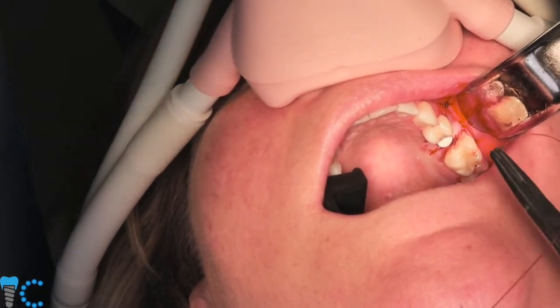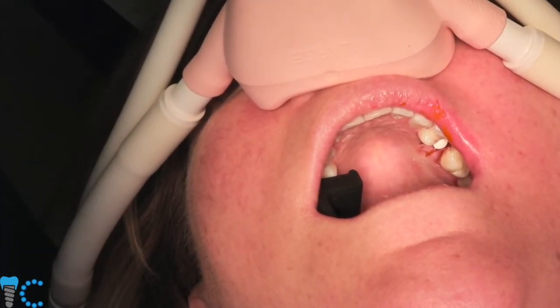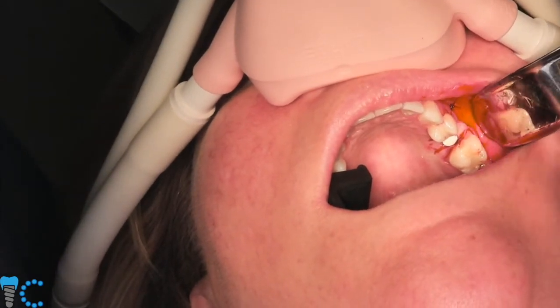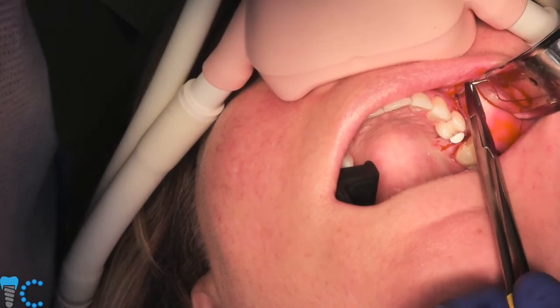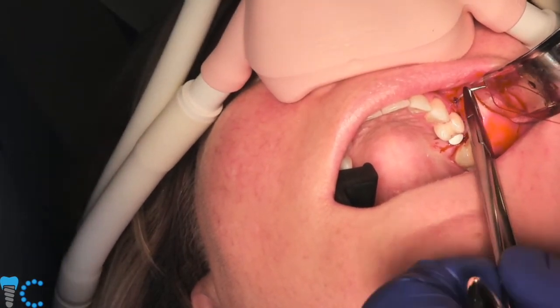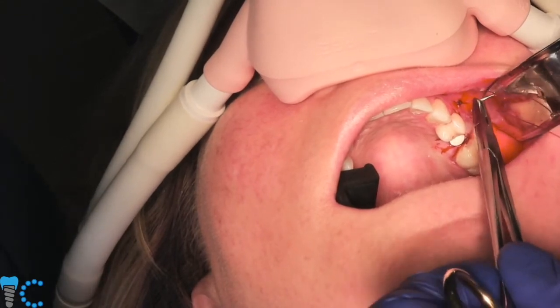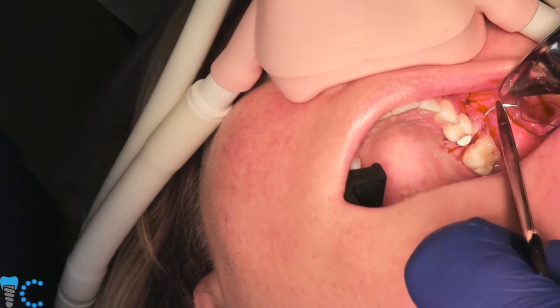So when we look at titanium implant surface, it could be a titanium disc, it could be whatever you want. In vivo, in vitro studies, they all agree that plaque and bacterial adhesion is significantly less on these ceramic surfaces as compared to a titanium surface.